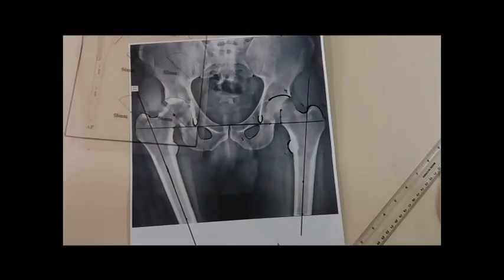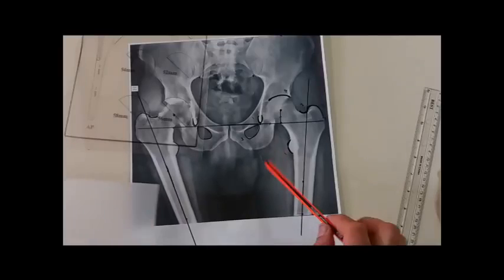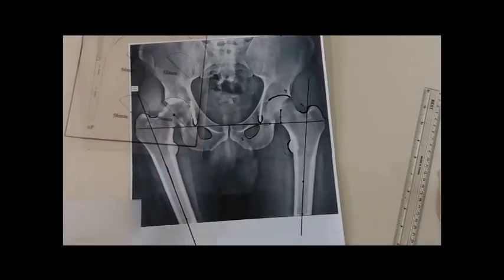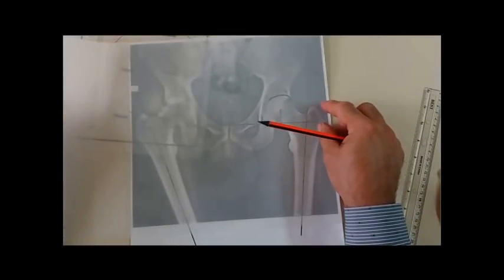The next step is to bring this tracing paper. This transparent tracing paper, as I said, is mandatory to compensate for the femur adduction. I superimpose this tracing paper on the radiograph as well as the template. I keep the template of the acetabulum in situ. So 3 layers. The first layer is the radiograph, the second layer is the transparent template, and the third one is the transparent tracing paper.